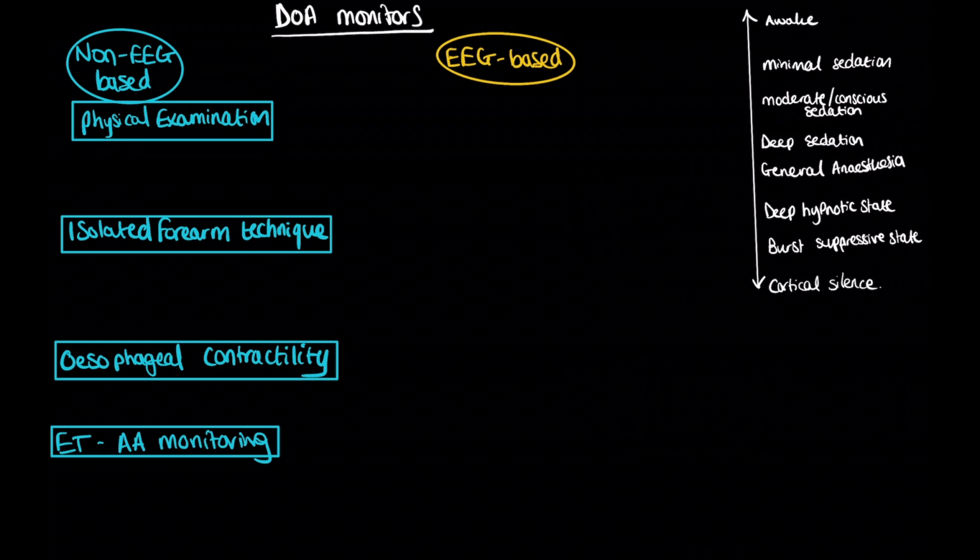There are lots of other methods to determine depth of anaesthesia, but they are either research-based or not used in clinical practice. You don't need to know those for the exam, and so I've not included them in this video. Let's quickly go through the non-EEG based methods before discussing the more important EEG based methods.